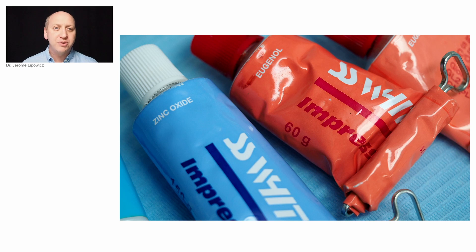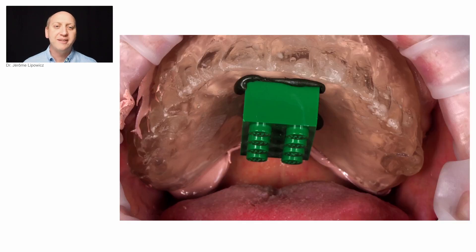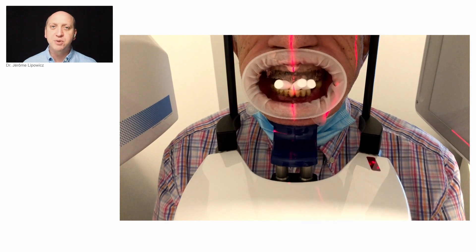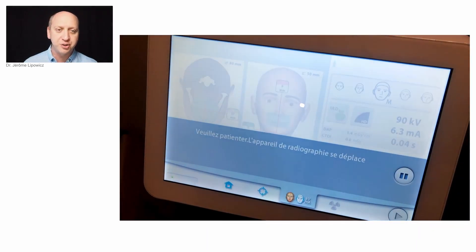And then we use that good old impression paste so we can reline the denture just like this. Now, the most important part is to proceed with the cone beam CT without removing the relined duplicated denture.